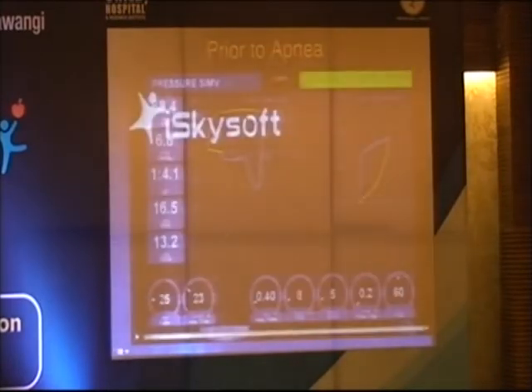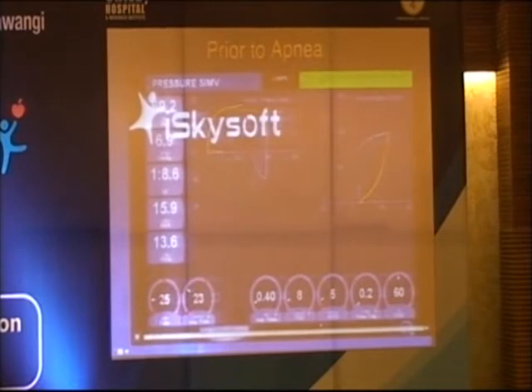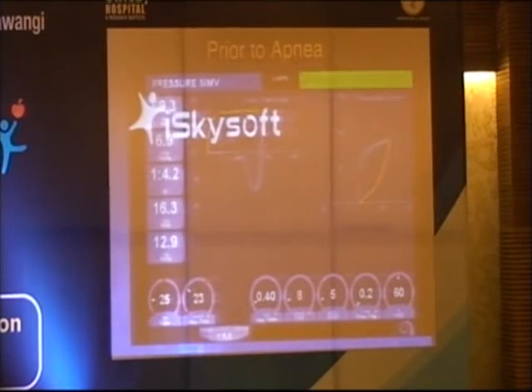So if we're able to, pardon me for this little thing up here, but I want you to pay attention to this flow volume loop. This is inhalation, this is exhalation. I want you to look closely at this. Something's going on. Is this a normal flow volume loop? No? Someone want to try to guess what's going on here? This is a very important graphic for your BPD kids.